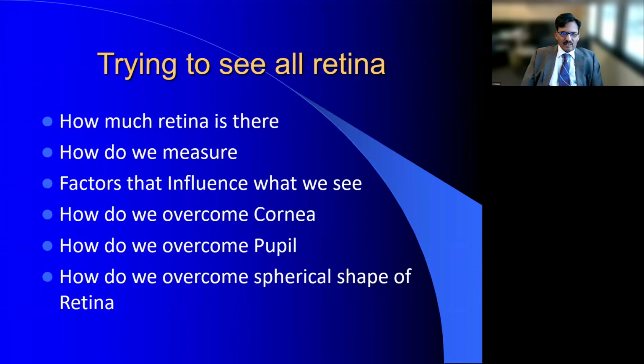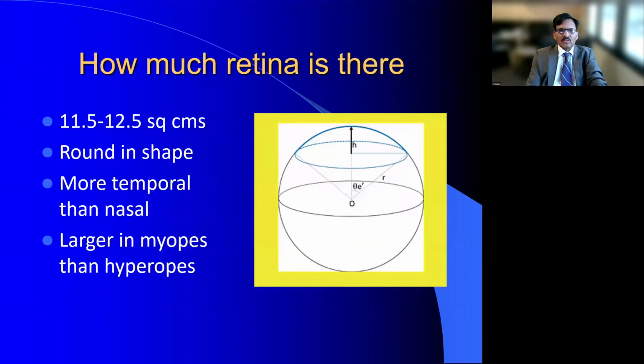of the retina. It would be very nice if it is just a flat screen. It's very easy to see. However, when you have a spherical screen, then you have resolution issues, aberration issues, and also depth of focus issues that may complicate not only visualization, but you're making decisions based upon the visualization in a 3D fashion. And so your hand-eye coordination, how does it overcome the challenges and deliver optimal technical delivery of the maneuvers you're trying to do? So let us start with the first one.